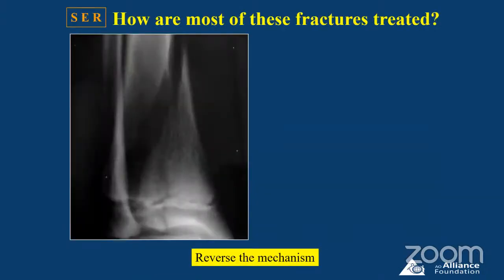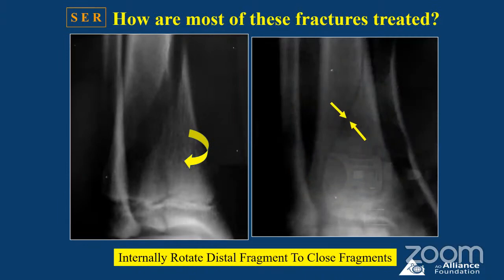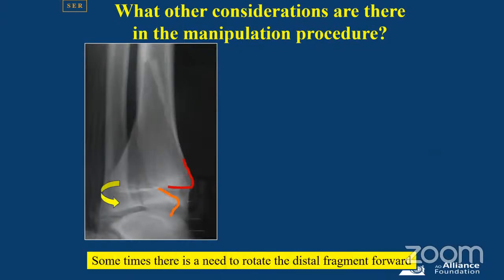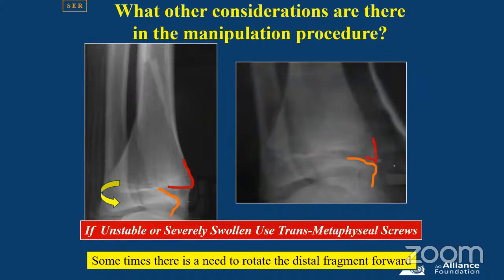And in these fractures, if you have a large fibular, tibial spiral, after you reverse the mechanism, it will close. And then you may use metaphyseal screws. Make sure on the lateral, the Salter 1 translation is also corrected. You may need to pull it forward and close it nicely in dorsiflexion. And then if it is highly swollen or unstable, you can use metaphyseal screws.